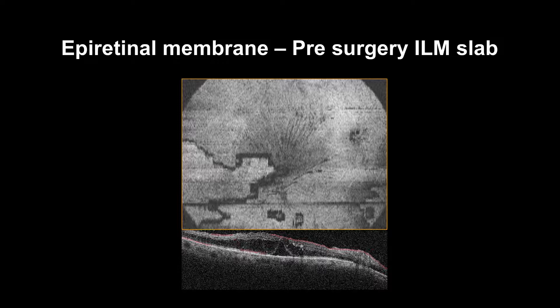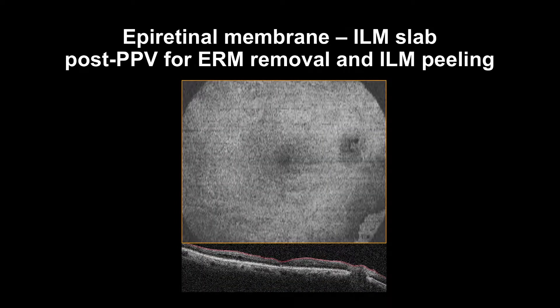This is the ILM slab of epiretinal membrane pre-pars plana vitrectomy. Please note the epiretinal membrane distribution and attachments, along with segmentation and blink artifacts. The ILM slab will show changes post-surgery to assess structural outcomes. A post-operative EnFace can show several dimples due to dissociated optic nerve fiber layer 30 days post-surgery at the macular area that underwent ILM peeling.